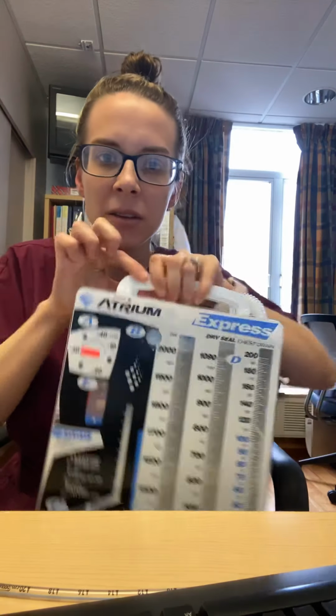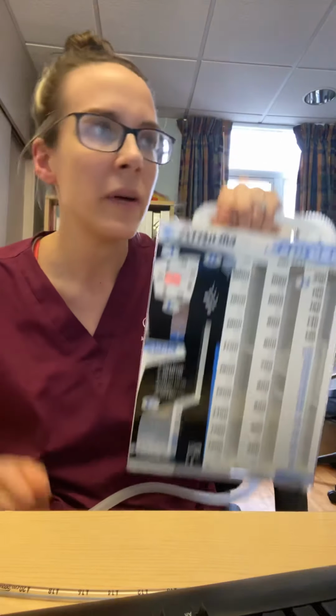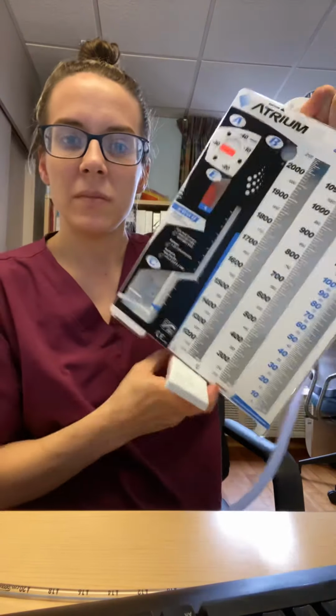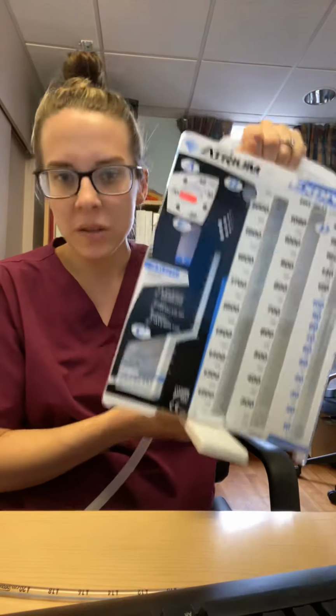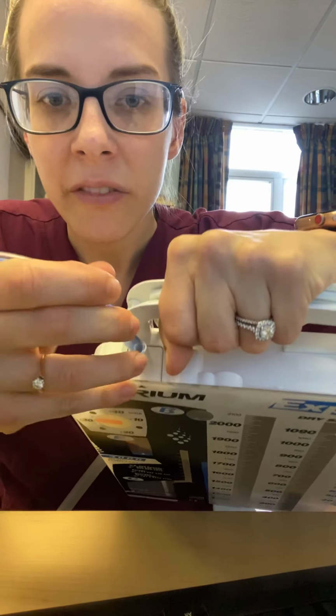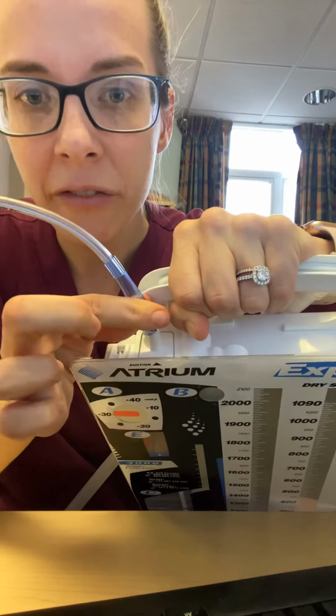Your carrying handle is right here. If you have to take the patient for a walk, or take the patient to a procedure, you can carry it right here. This has a little stand on the bottom that kicks out. The only time that I use the stand is if I'm pulling the suction tubing off of here and it's really difficult, that I'm having a hard time getting it off for some reason.